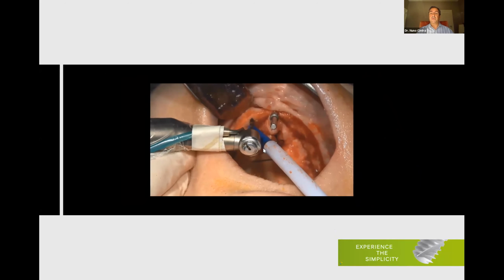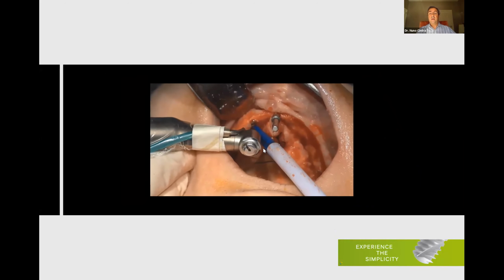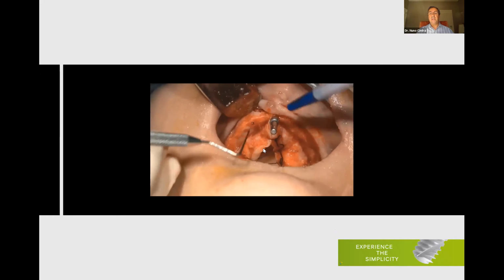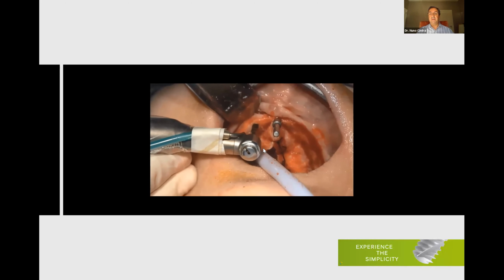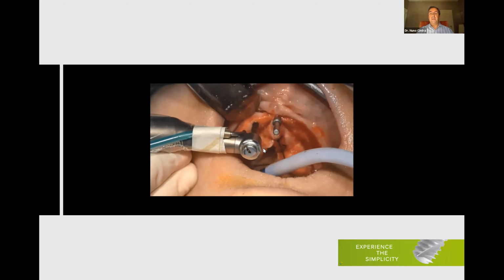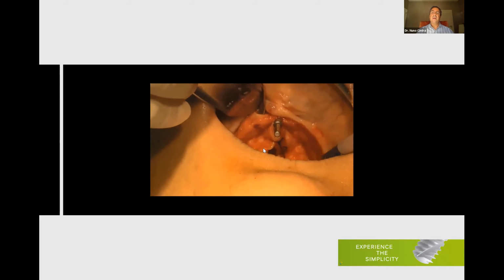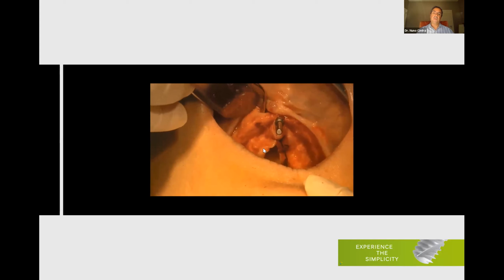We can change anatomy. Of course, we can lift the sinus, or we can even lift the nasal floor, like I'm doing here. As you can see, I have 6 millimeters height, so I can change it by grafting and by lifting the nasal floor, and be able to place a 10 millimeter implant. It's very easy. It's easier than the sinus, because the membrane is thicker, as you can see here. It's very easy to lift the nasal floor membrane. And what I do is I do my preparation, making sure that I perforate the nasal floor, and then I will place my graft. Of course, the graft material, it's up to you.